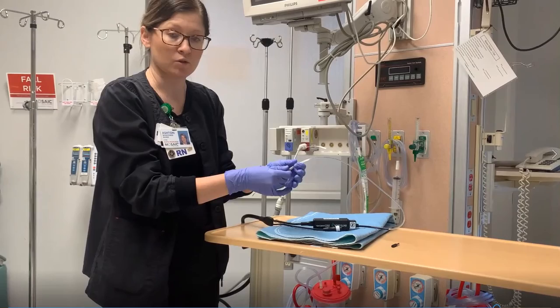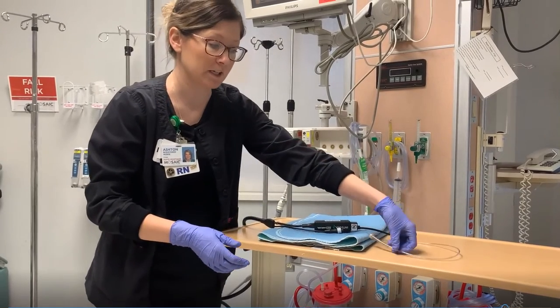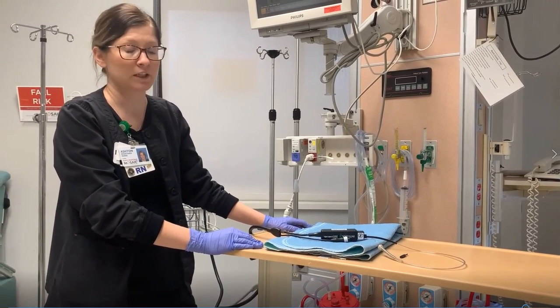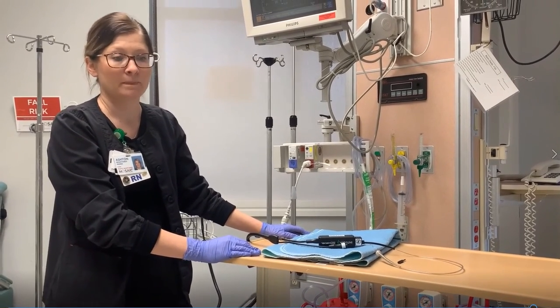A normal ICP is between zero and 15. Anything greater than 20 for more than five minutes is an emergency — we probably need to let the provider know, and that's really it.